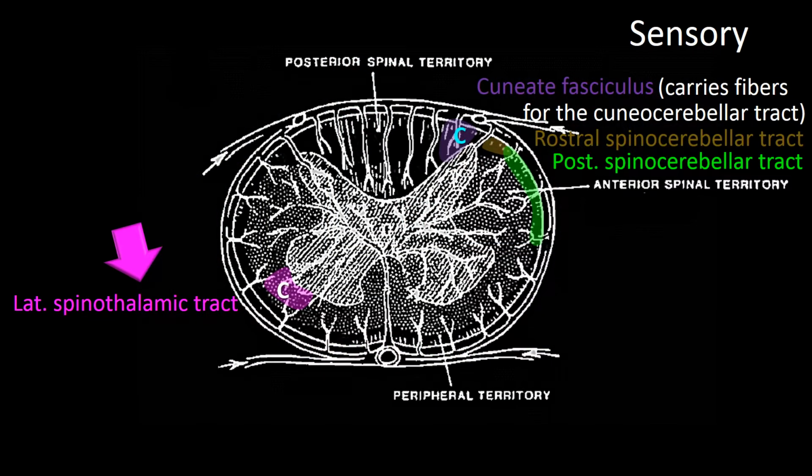The lateral spinothalamic tract, although unlikely to be a significant contributor to a cervical recorded potential, may do so since it carries information from the median nerve territory through the cervical spine towards the thalamus. Again, its contribution would be limited to the traveling field produced by the electrical volley. The dorsal spinocerebellar tract is not activated by median nerve stimulation since it carries fibers from the lower extremities.